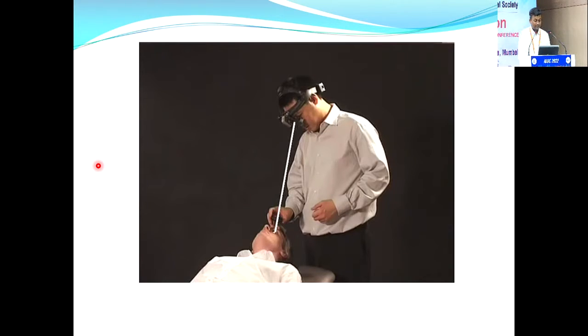So this is the examiner doing indirect ophthalmoscopy. As soon as you put it on the head, adjust all the settings, and then you put the light on the patient's eye, and then bring the lens in front of the eye, and just bend backwards, and adjust the light accordingly so that it goes directly into the eye, so you get a good view.